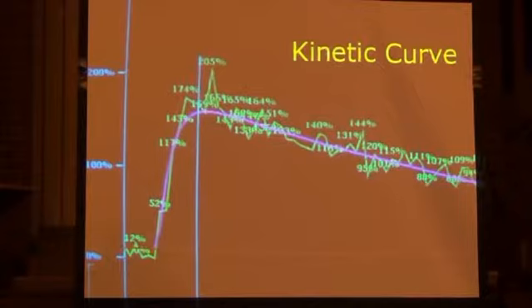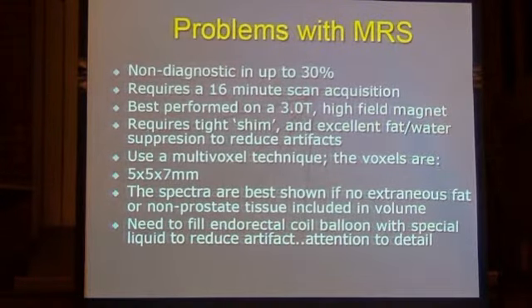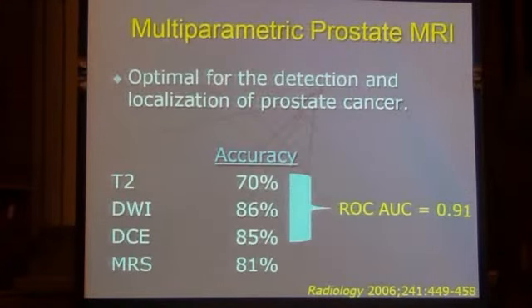And sure enough, the guy calls back and says, damn, how'd you know that? I've been trying to hit this thing for months with this, and I got it in the first pass because it's targeted. So we took it one step further. We said, why don't you do it under MRI? Take the same information and go get it under MRI because you have the tissue and you have good anatomy with the MRI.